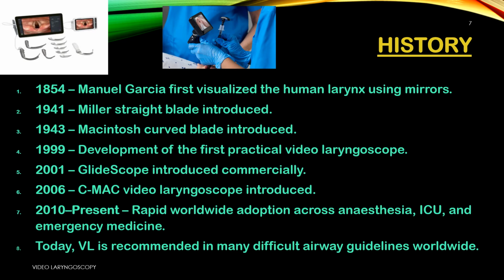5. 2001: GlideScope introduced commercially. 6. 2006: C-MAC video laryngoscope introduced. 7. 2010 to present: Rapid worldwide adoption across anesthesia, ICU, and emergency medicine. 8. Today: VL is recommended in many difficult airway guidelines worldwide.